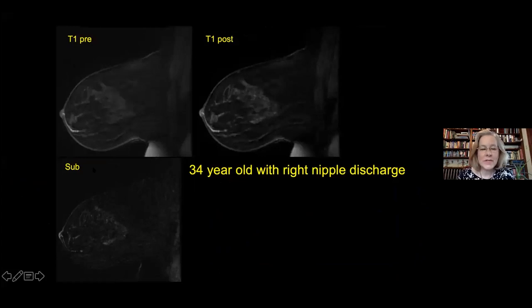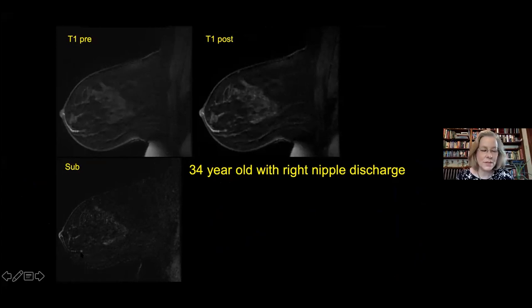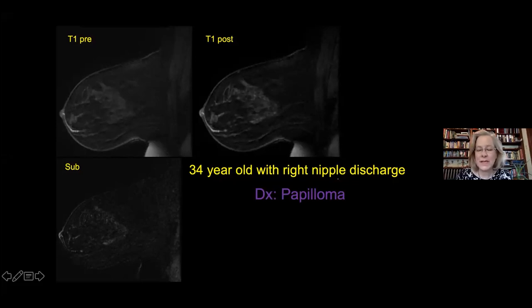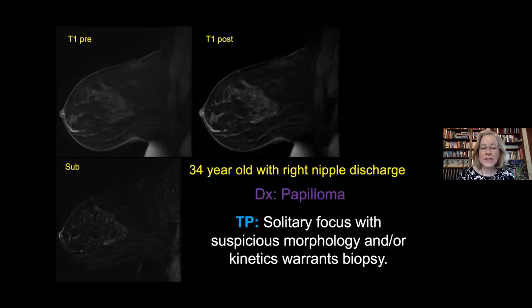A patient had right nipple discharge. On T1 pre-contrast, there's T1 increased signal in a ductal distribution—a duct with bright material, either proteinaceous or hemorrhagic debris. On post-contrast you can still see the T1-bright signal. On subtraction, there's a little focus at the end of that duct. This was biopsied and turned out to be a papilloma—the most likely finding in the setting of nipple discharge. A solitary focus with suspicious morphology or kinetics really should be biopsied.